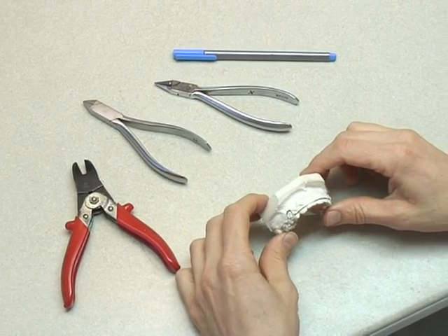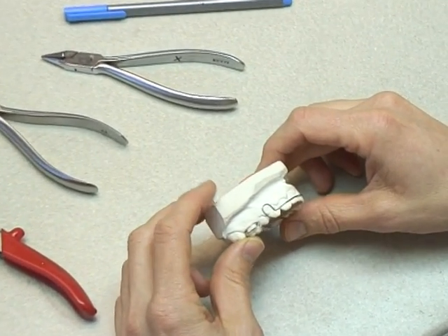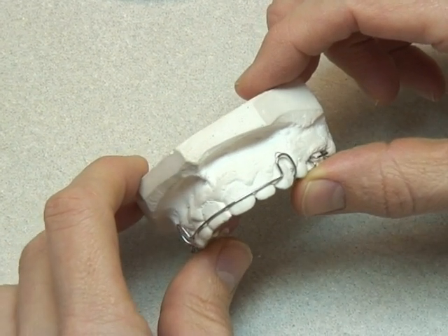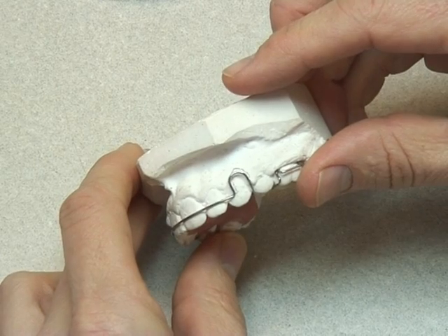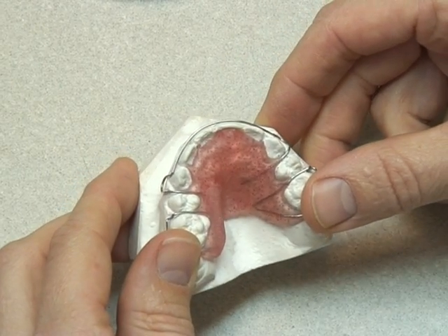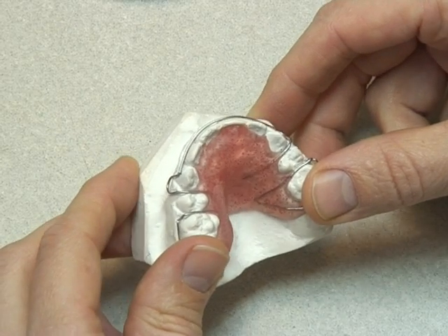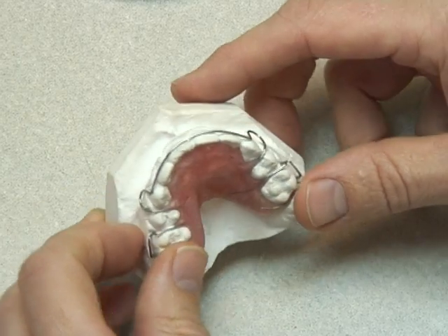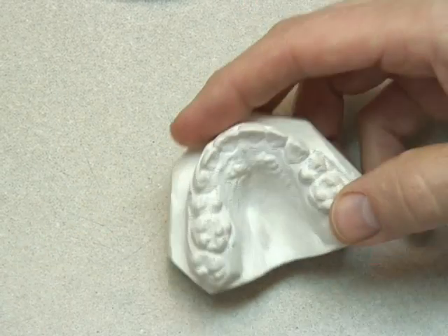Hello and welcome to this video demonstration of the labial bow. This is an ideal labial bow, one used typically in a Hawley retainer, or for the retentive phase of treatment. It's made from 0.7 or 0.8 stainless steel wire, contacts all the teeth in the arch, and has two equal-sized U-loops that follow the shape of the arch.